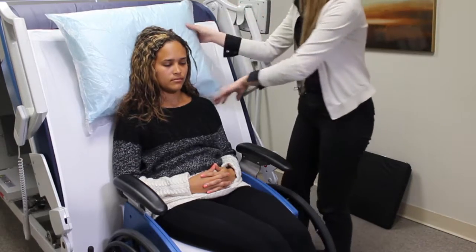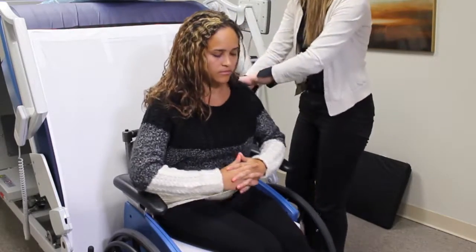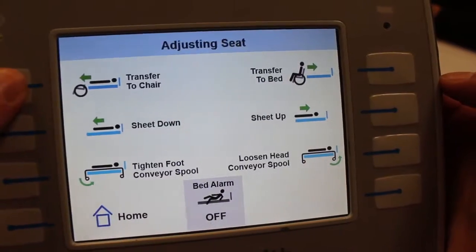You lift the back of the chair like normal, remove the pillow, and continue the transfer to the chair.